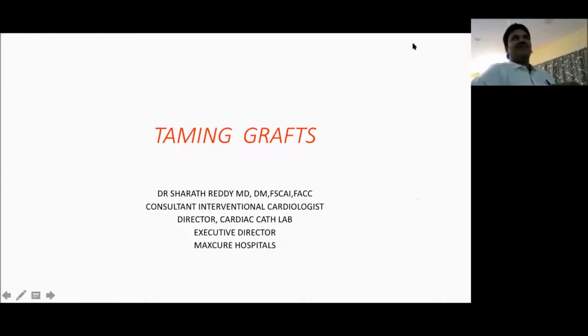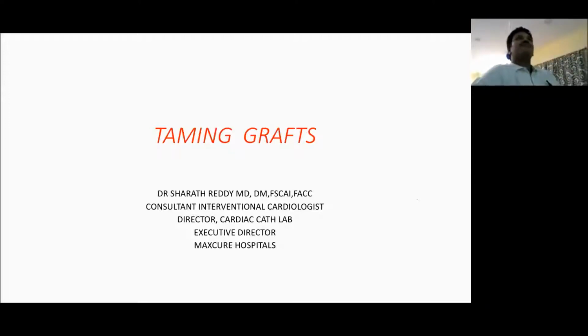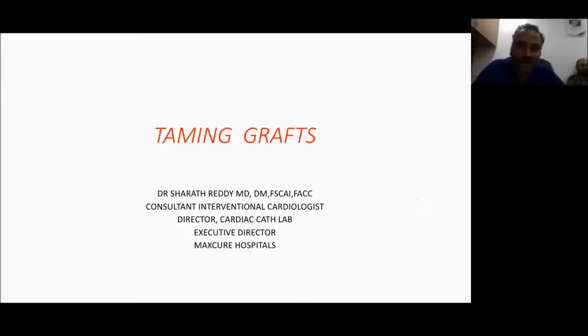What we did a couple of times in such situations: to start with, the first thing we did was an aortic root angio. Instead of poking around with a lot of things, after the native coronary angiogram, first we did the aortic root angio, and then went for surgery after that. In my practice, what I learned in the last 5 years is that if I don't have any information on grafts, at least the number of grafts, CT angio is better. I would love to do a CT angio. I don't do conventional angio.